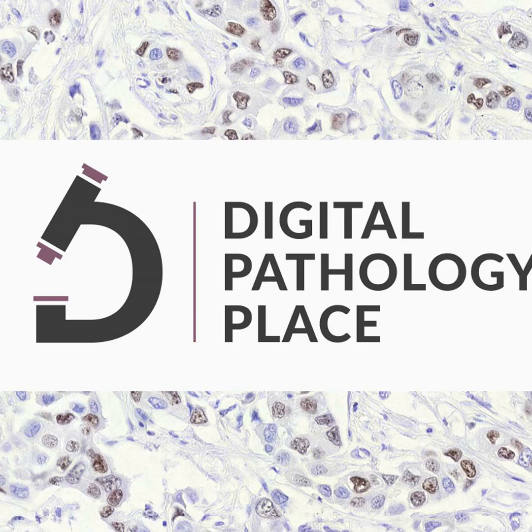9. Computer vision. Computer vision is a branch of computer science that focuses on enabling computers to understand and process visual data. It is fundamentally about teaching machines to see and interpret images in the same way humans do, but with greater accuracy and consistency. In the field of pathology, computer vision techniques are applied to analyze microscopic images of tissue samples, enabling automated disease detection and diagnosis. 10. Graphics Processing Units, GPUs.